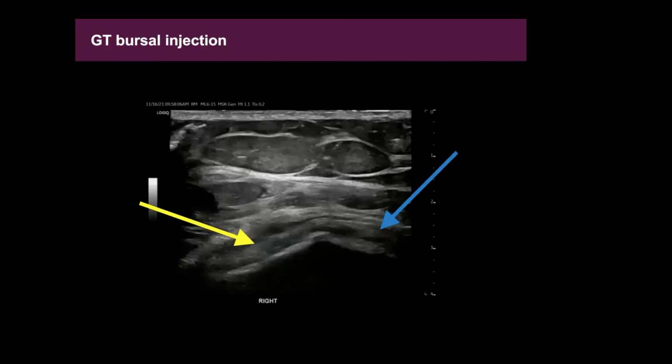So say you've looked at the anterior facet and the lateral facet and the minimus and the medius are intact, but the patient is still complaining of pain. Well, you could use that same visit to go ahead and inject the greater trochanteric bursa. Again, my images aren't playing, but that's what we would do.